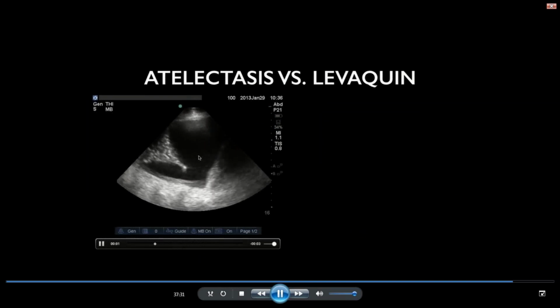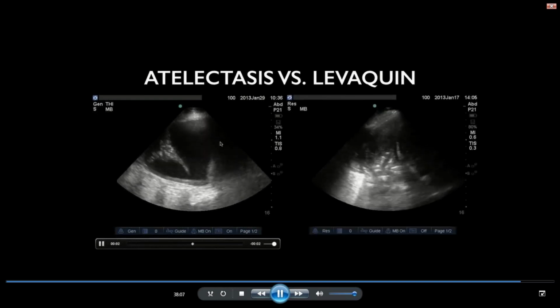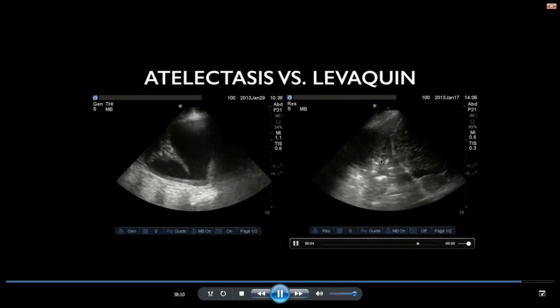This is one of our patients who's had shortness of breath and discomfort post-operative for a long time and has collections bilaterally in the lung. And we chose to not treat this patient with antibiotics as he's had these findings of post-compressive atelectasis in his lung tissue, and this does not represent a consolidation. In a chest x-ray, you would just see this as a white opacity, and it would be very difficult to triage, as I said earlier, the most suitable management. Versus this patient was treated with antibiotics for presence of a consolidation in the lower lung field.